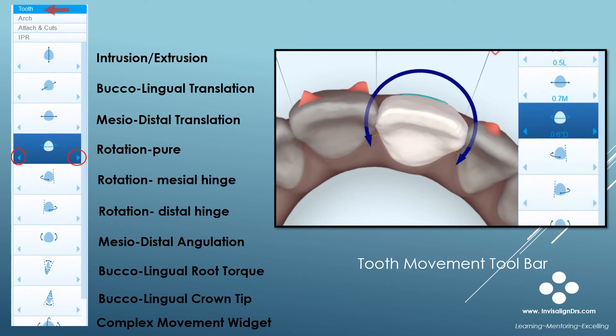The tooth interface allows you to view and modify all movements for any tooth. This slide shows the toolbar — I've added descriptions for each widget. You click on a tooth, and the change in movement values for that tooth will appear on the toolbar. In this example, I've clicked on tooth 9.